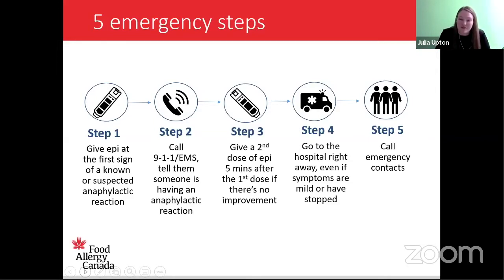they are really very safe. Right. And it's probably a good reason to have 2 devices as well, in case the first injection is not properly administered.